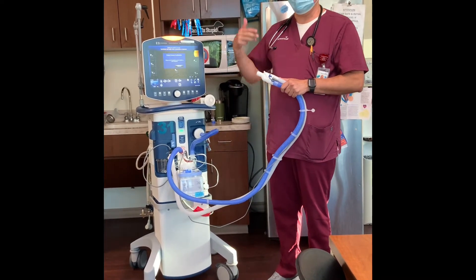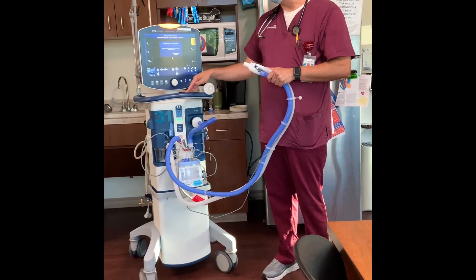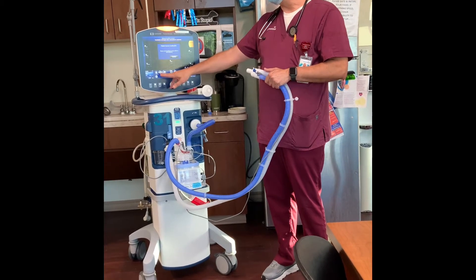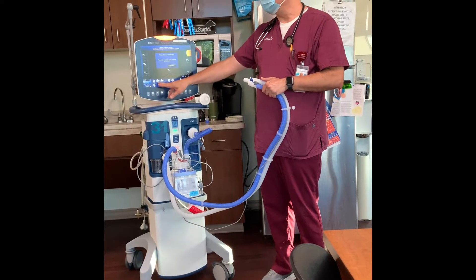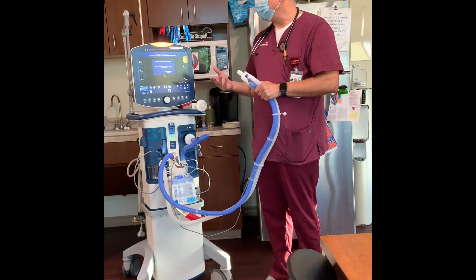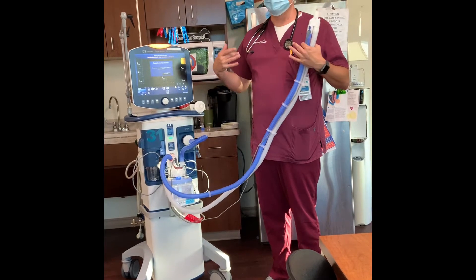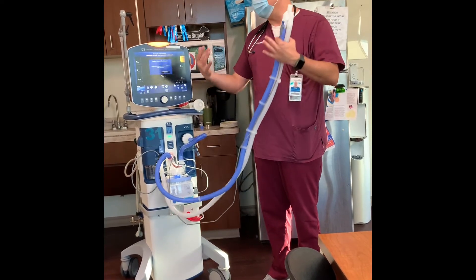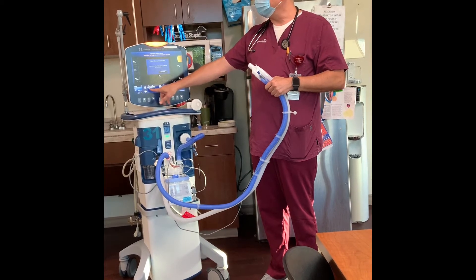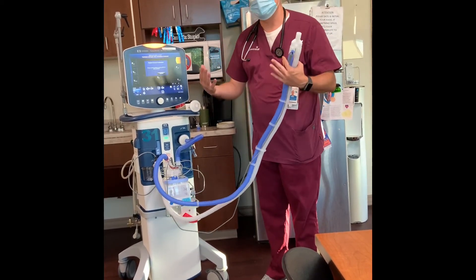The patient is able to breathe over the set rate if they are spontaneously breathing, but minimum they're going to get 16 breaths a minute. The next setting is tidal volume — here it's 420 cc's. That is how much air gets pushed into the lungs by the ventilator with every breath. So at 16 breaths a minute, they're getting 420 cc's of air pushed in to ventilate.